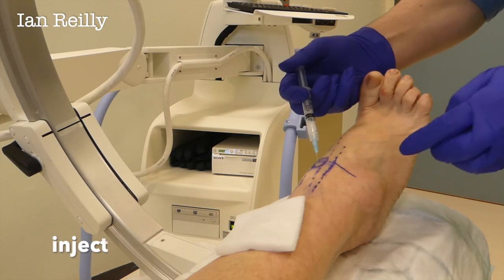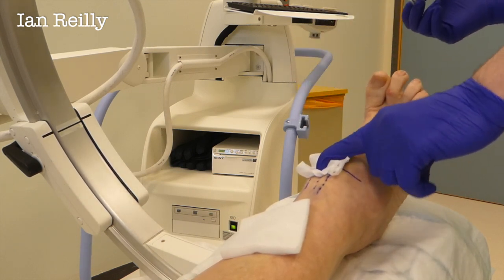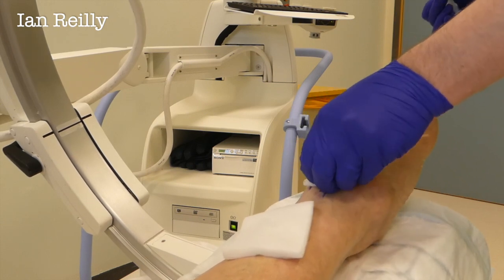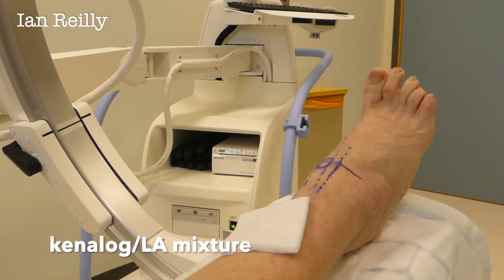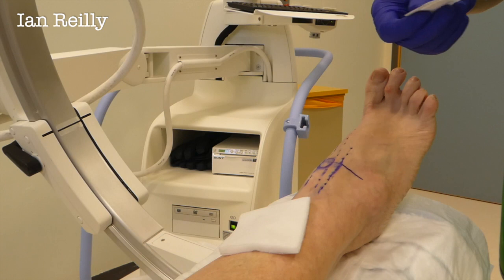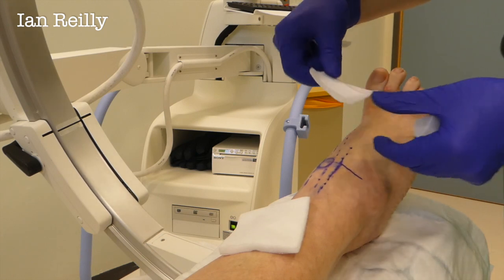So what I'm putting in is Kenalog, 40 milligrams. Kenalogs are my favorite joint injection — it's a nice strong steroid. And I've put in a little bit of local anaesthetic as well. So over the next five to ten minutes that'll take away the pain, and that's useful for me because if it takes away the pain, it also confirms that the steroid's in the right bit.